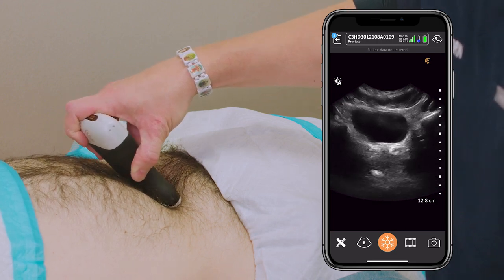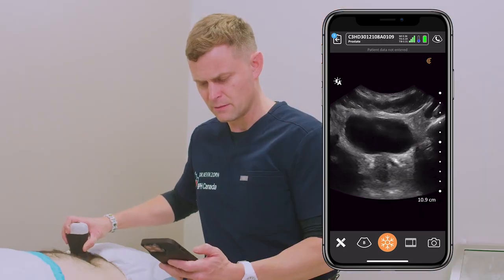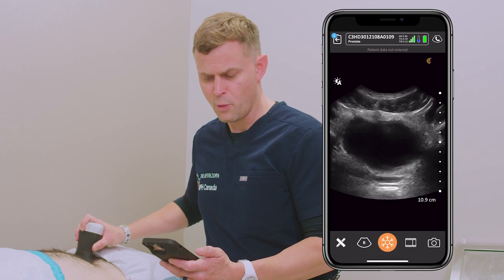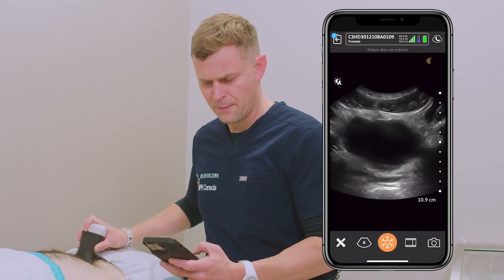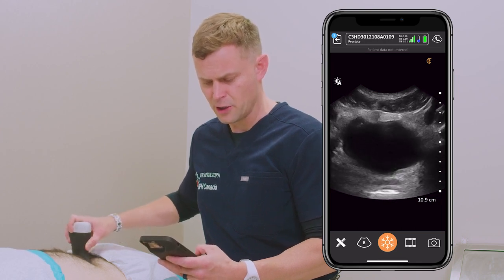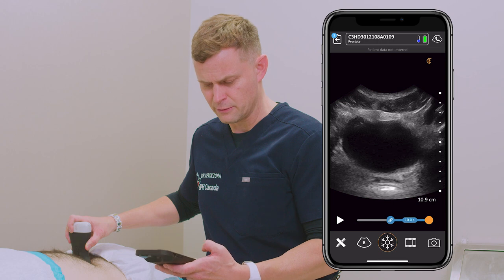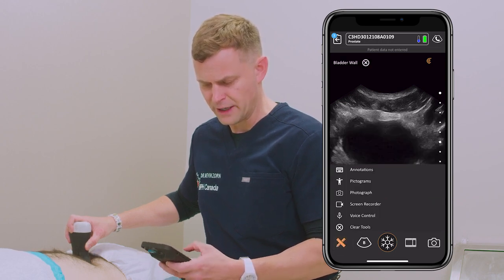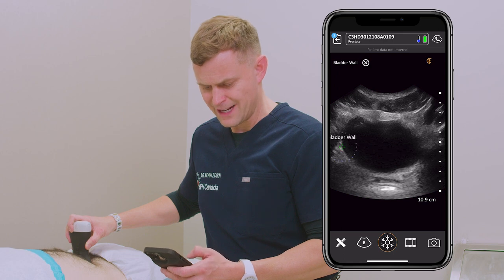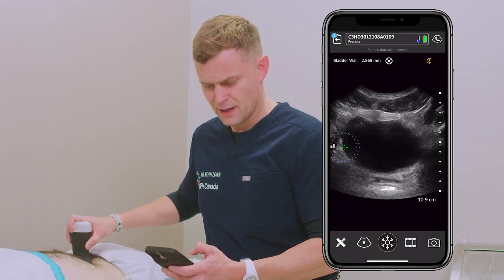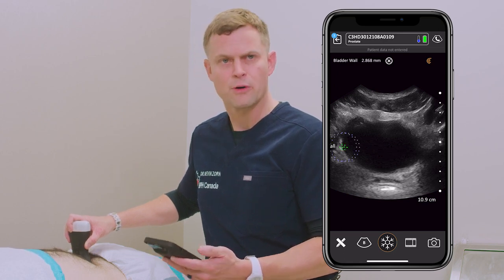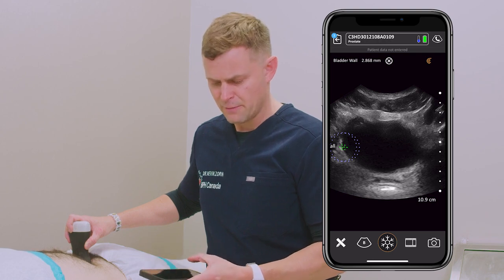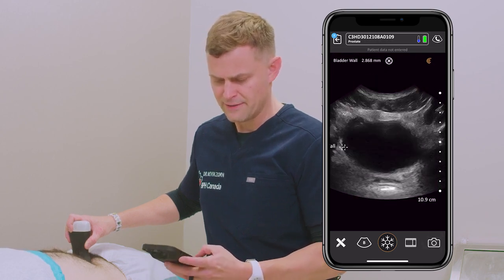Scanning up and down, clearly a nice homogenous smooth wall of the bladder. I'll pick the largest aspect of this bladder, which looks pretty full, and go ahead and measure the bladder wall thickness. Typically this gives us an idea if there's some hypertrophy of the prostate which will create more resistance, a bladder outlet obstruction, and create some thickening of the bladder wall. Let's go ahead and save that image.